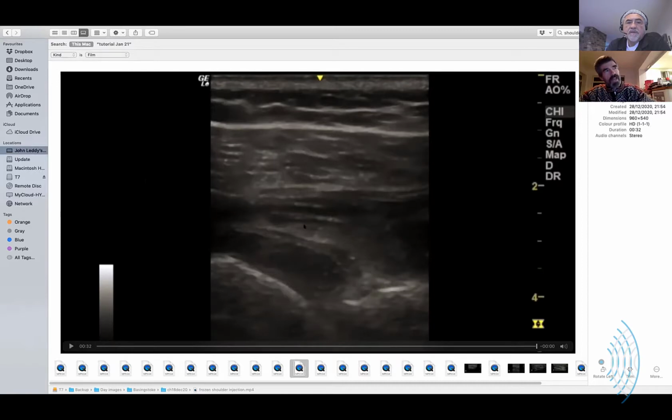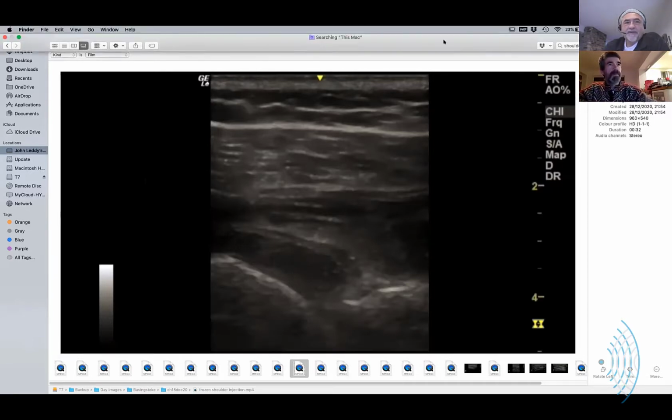Sometimes, because of the way the image is built, it's not always optimal to see. You're not getting the right angle on it to see all the way down the image throughout, but you do need to see the tip. And on these, some days I'll do 3 or 4 just of this injection. So I tend to do them in my sleep, but you should always have.